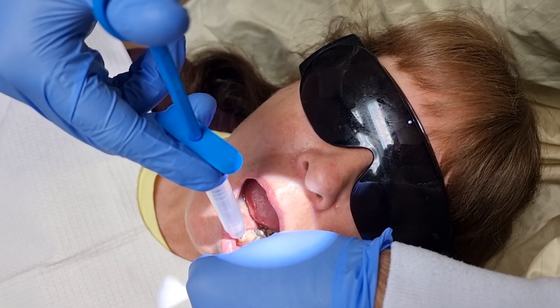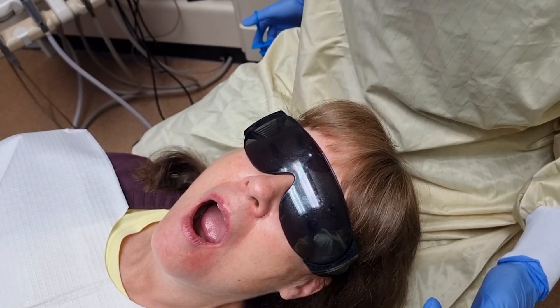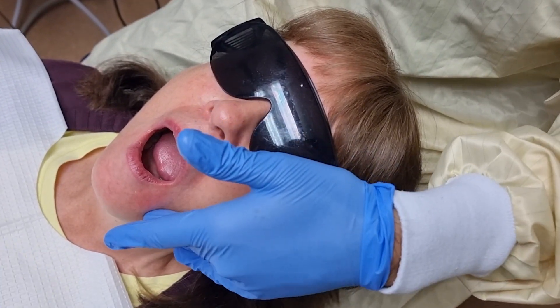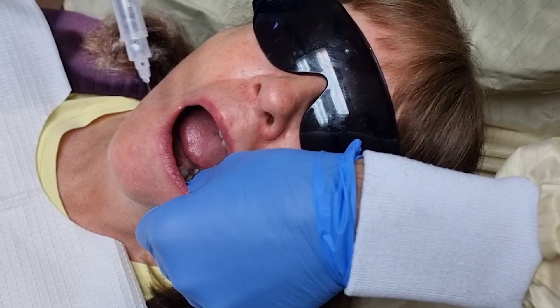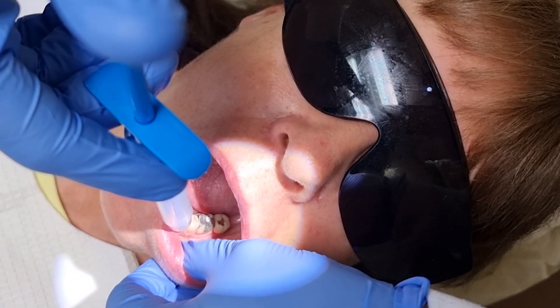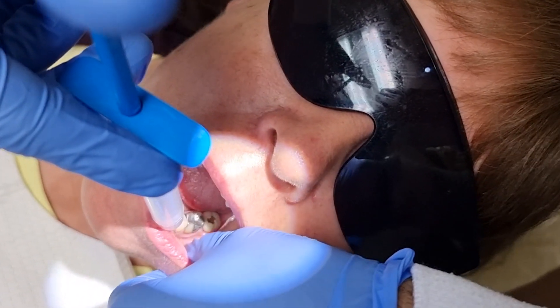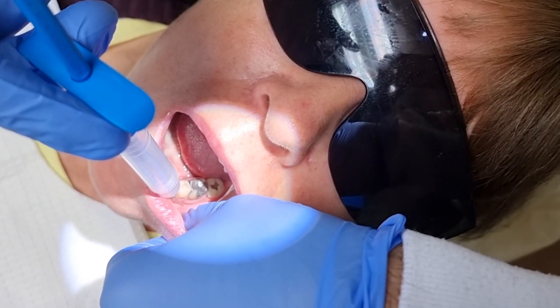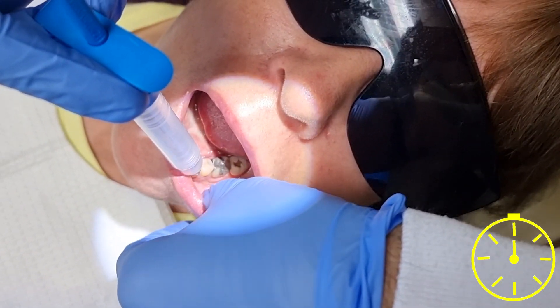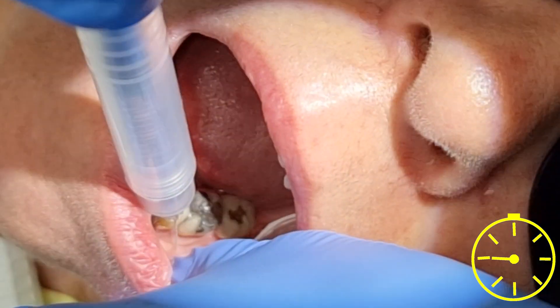For the most comfortable technique, just a drop to start — we've got a drop inside and already that'll be working. Did you feel that entry point there? That's a great sign already. Once you get the few drops in and you don't feel anything, we're winning already. So now when I go in I can give it much faster, though we still want to maintain the good technique of massaging the area. Nice and slowly.